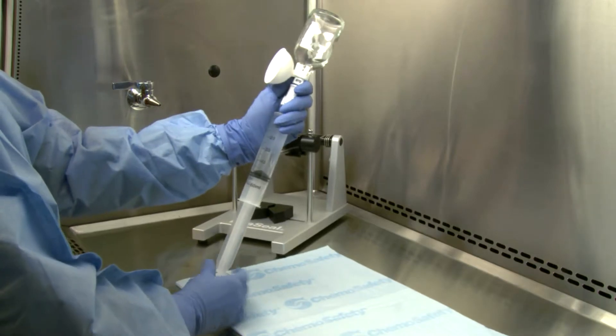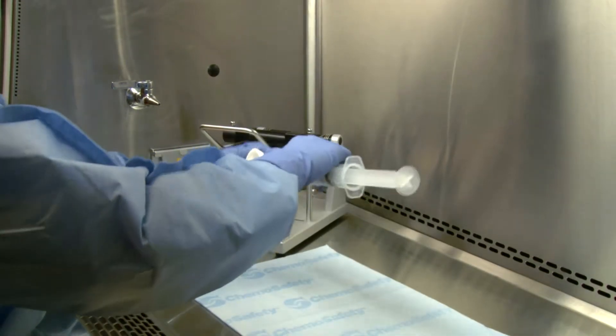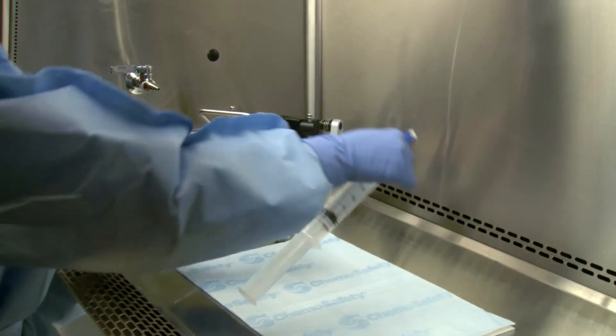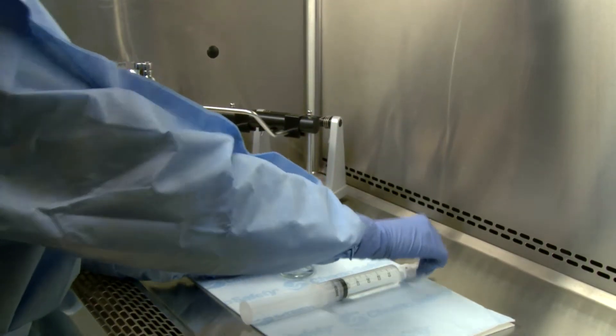Invert the system and aspirate the drug into the syringe unit. The expansion chamber will now deflate. Then disengage the syringe unit from the vial assembly using the pull-turn-pull technique. The syringe unit containing the drug is now ready for administration or further preparation.